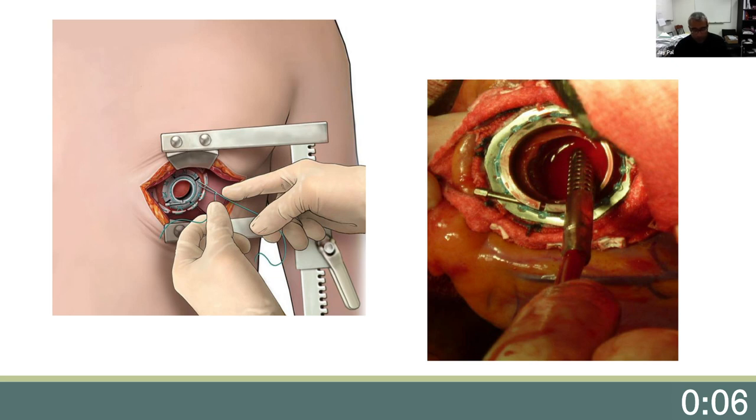Here are some close-ups of the sewing ring. I do orient the pin of the HVAD hardware so it's pointed towards the medial aspect of the incision. In these pictures, pledgeted sutures are used to secure the sewing ring, but I've gone to running a Prolene suture as I find that faster and more hemostatic.